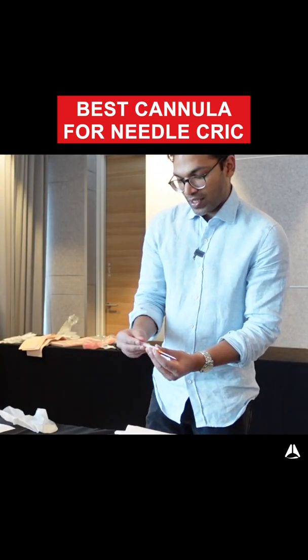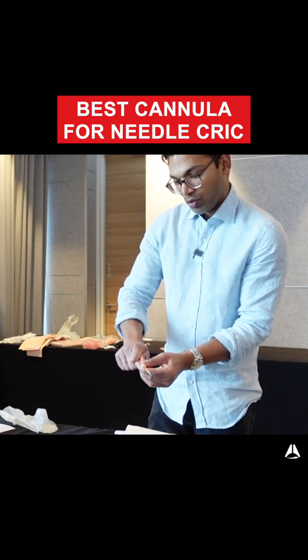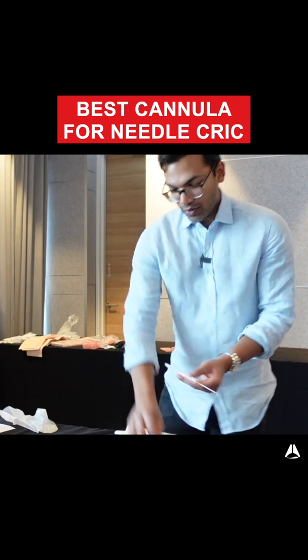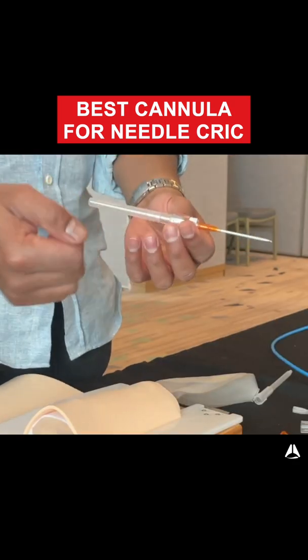This is another Insight cannula, but it's a safety cannula and it's really hard to take the tip off. It's not normally able to come off and you can't really attach a syringe to it. This cannula just won't do — it's a safety cannula, so it has a needle that retracts.